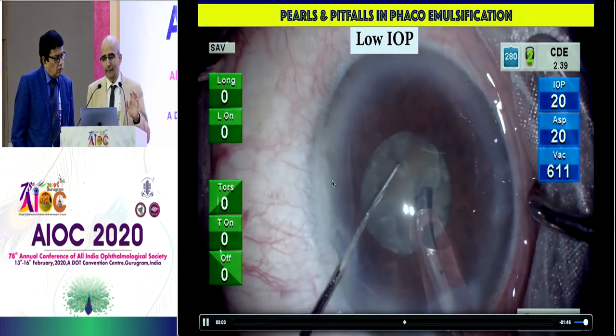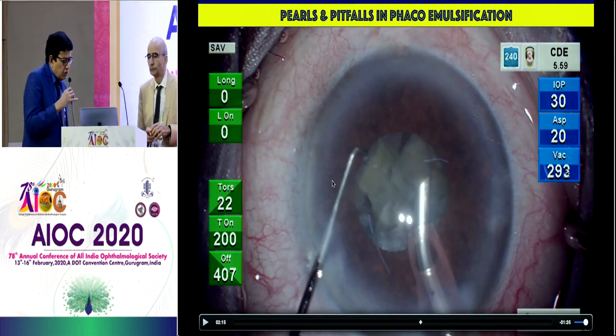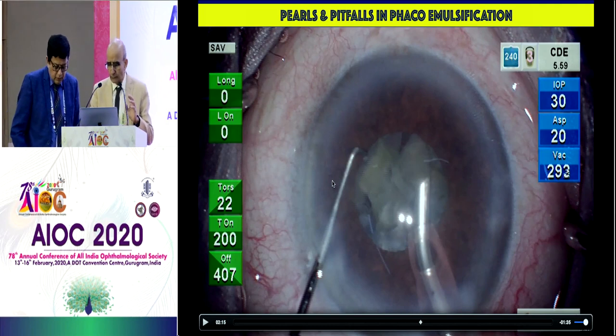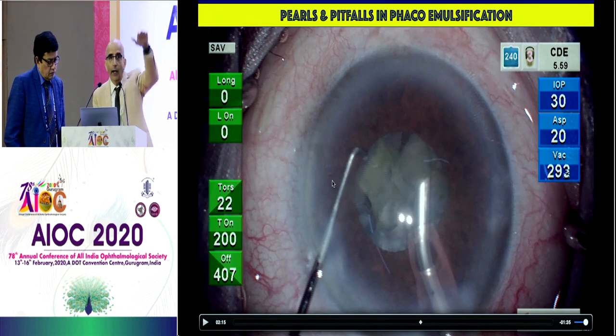In spite of my low IOP — I had a 28 to 30 centimeter bottle height with very low aspiration — the pupil kept constricting because the dense fragments come in vicinity of the sphincter. Regarding whether raising IOP from 20 to 30 keeps the pupil dilated: raising the bottle height actually has very little, if any, effect on dilatation. What it does is send more fluid behind the iris, pushing it more towards the incision. So resist raising the bottle height too much. I use 30 to 40 centimeter bottle height, but not more than 50 centimeter generally.